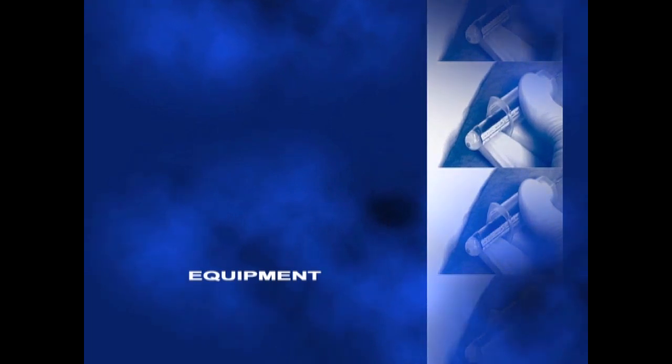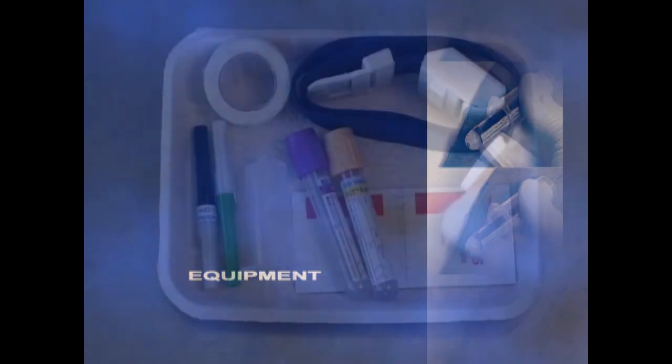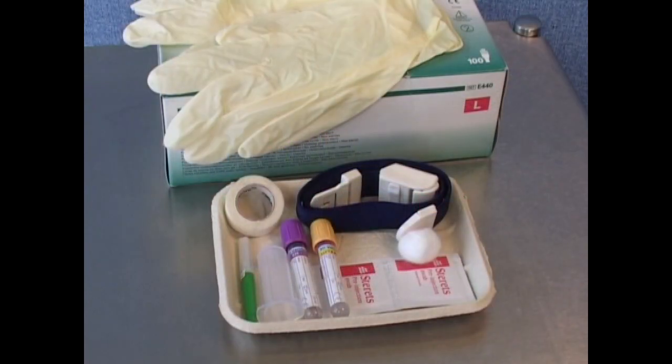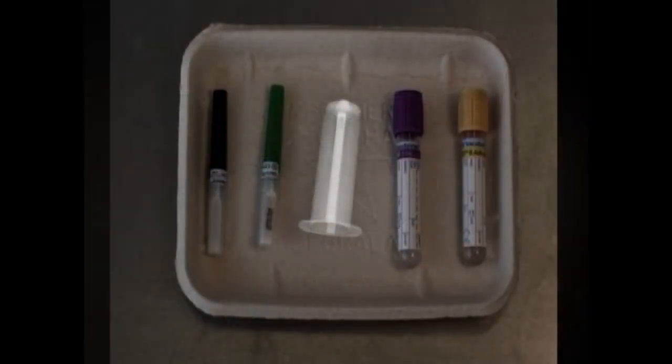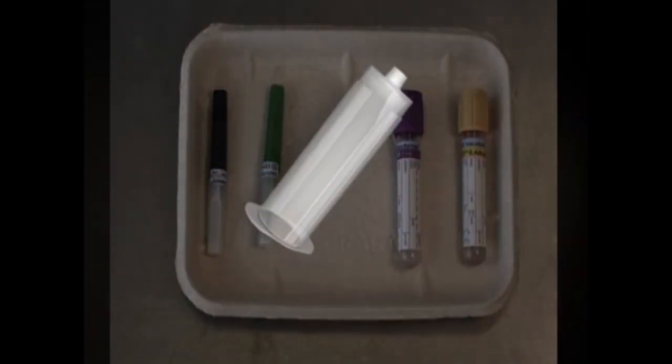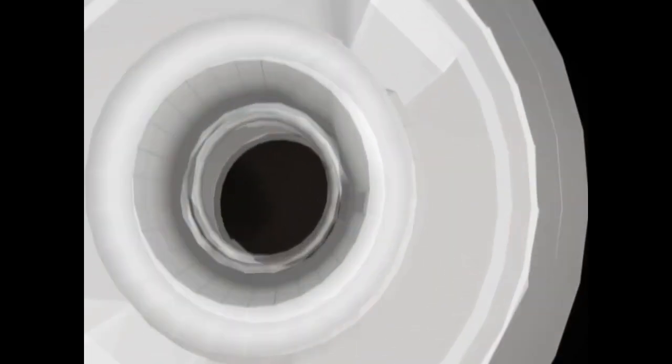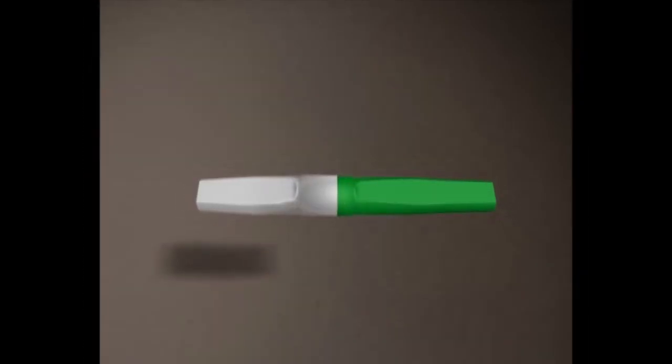Vacutainer is one of the systems commonly used for venipuncture. Its design and components are standardised and this greatly reduces the risk of needle stick injury. The barrel is designed with a screw top which attaches to the chosen needle. It also has a hollow body which allows access for the vacutainer tube.